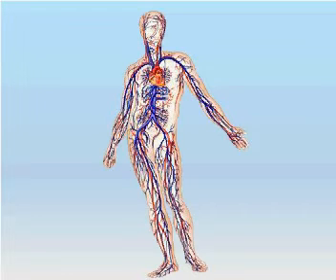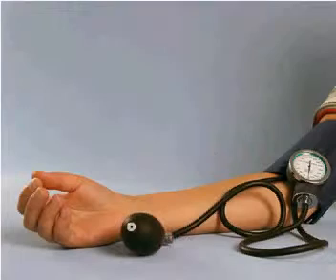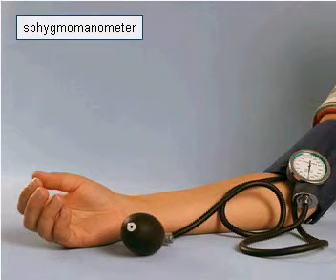Changes in the functioning of vessels as well as the heart rate affect the speed of the bloodstream, and hence the value of blood pressure. The pressure can be measured directly, which is usually the case within highly specialized hospital wards, or indirectly using a blood pressure cuff or sphygmomanometer.